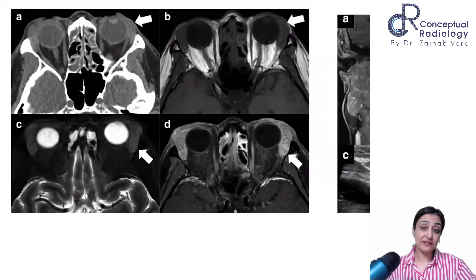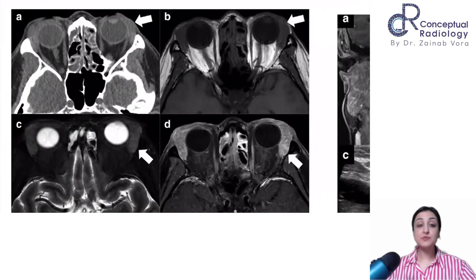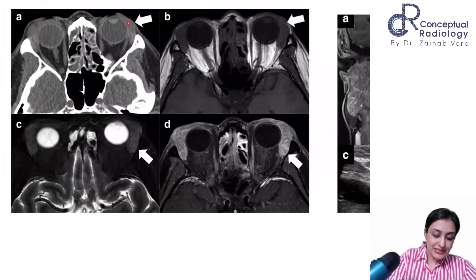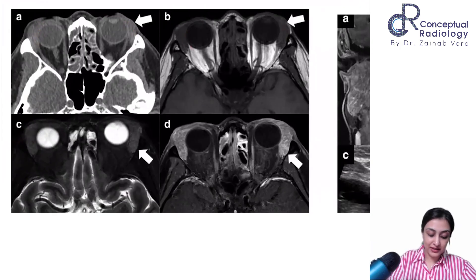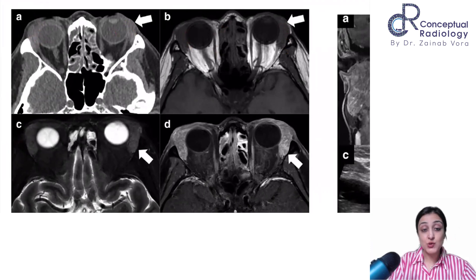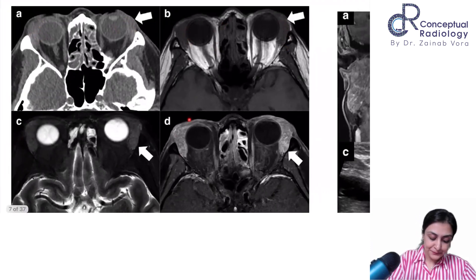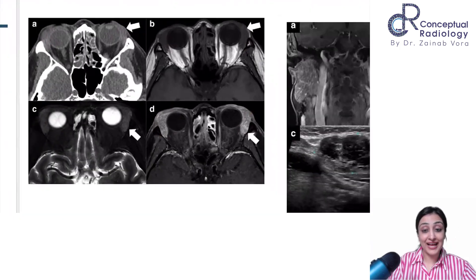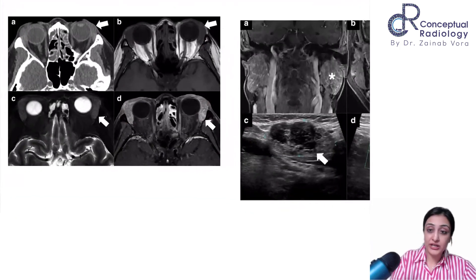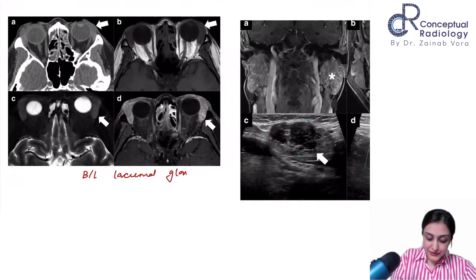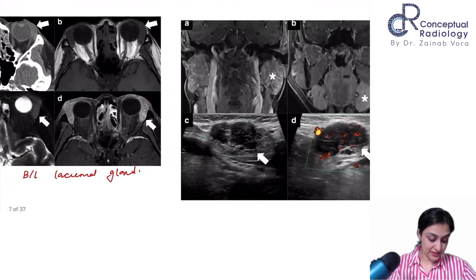First case: this is what was previously called Mikulicz's disease. Bilaterally, you can see how the lacrimal glands are bulky — bilateral dacryoadenitis — with avid enhancement. This is bilateral lacrimal gland swelling.